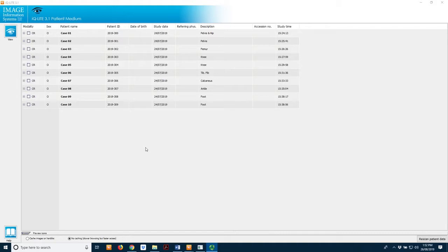This presentation is feedback on the practice bank that I've given on the pelvis and the lower limb. Please ensure that you have your preliminary image evaluation form at hand so that you can self-mark as I give the feedback.